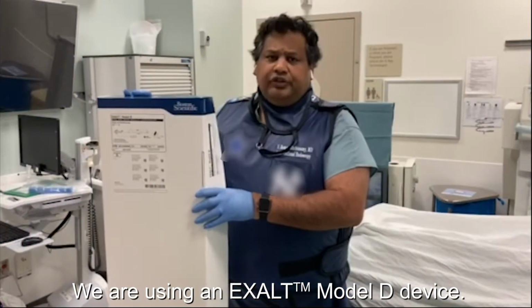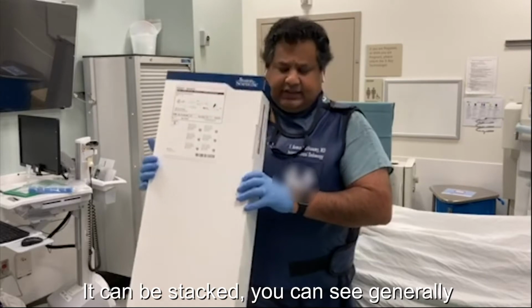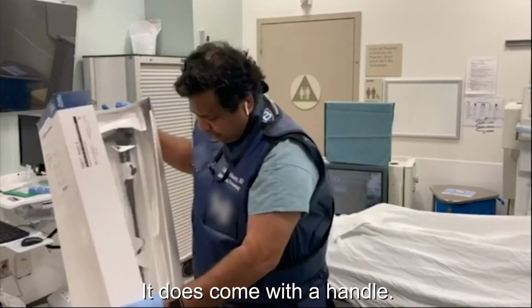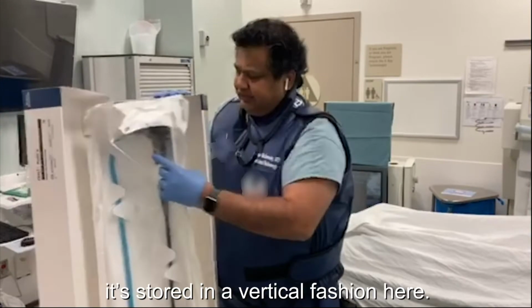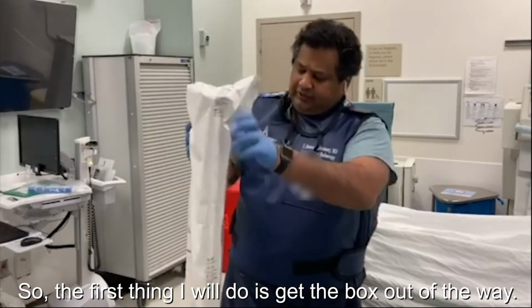So we're using an EXALT Model D device. This is literally the package that it comes in. Often it can be stacked. You can see generally how much space it takes here. And so we're literally going to take this out of the box. It does come with a handle. And you can see as you take this out of the box, it's stored in a vertical fashion here. So the first thing I'll do is take the box out of the way.